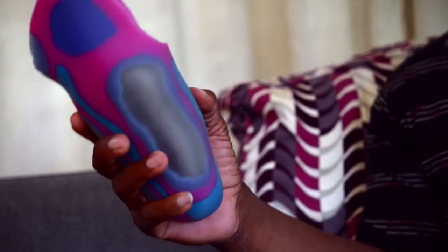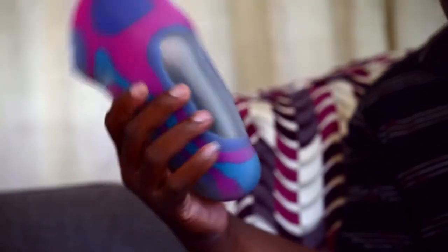All of these reliefs are based on data. Clearly, MRI is not readily available to everybody, and perhaps there are different tools like ultrasound, or we can use cell phones to capture data.